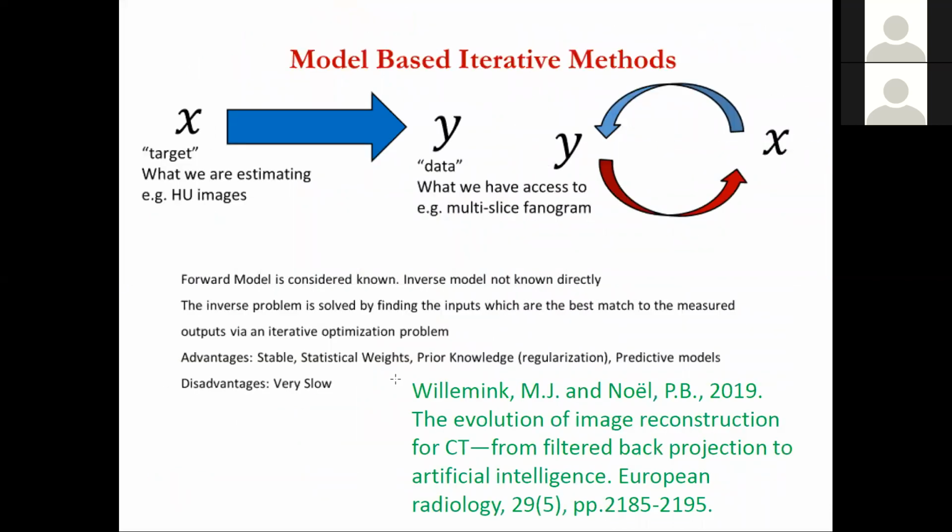So, okay, that's all a long way of talking about analytic reconstruction. Analytic reconstruction was where you traditionally said, okay, I'm just going to invert this. This line of response, I'm going to use filtered back projection and map that way. Now, model-based, you're using a forward projector, where you go from your model, from the source to the projection space. You think you know what the projection space data should be on average, and then it's going to have statistical fluctuations, it's going to have electronic noise, and then it can also have background. So basically, you're making a model of the whole system and other effects like dead time losses.